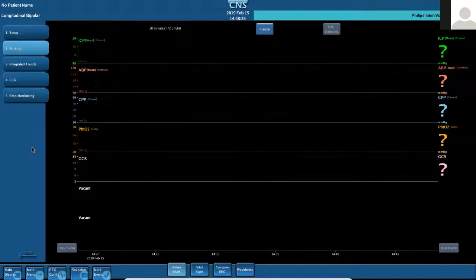But yeah, I thought that would be just another little tip that we could throw in there while we were waiting for any other questions to pop in. That's a great one. Thanks. Any others? Anything else that you've played around with that you have learned and really like?